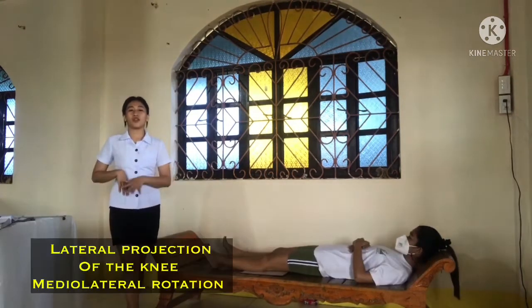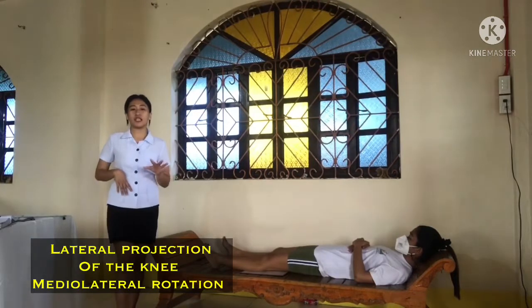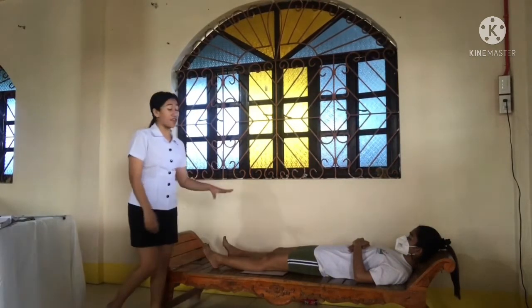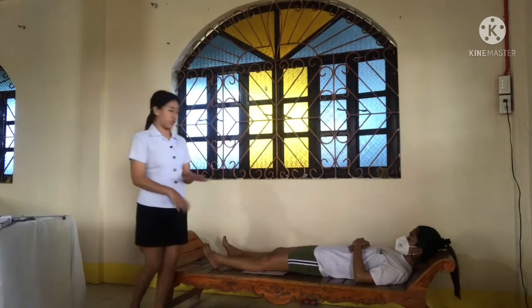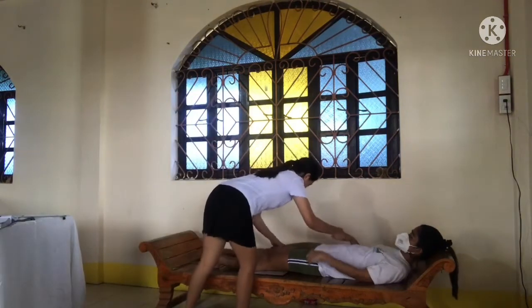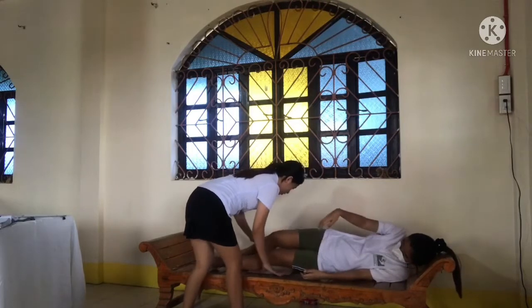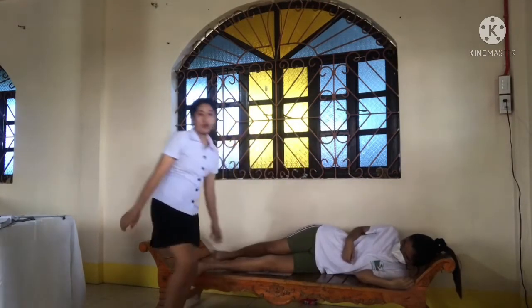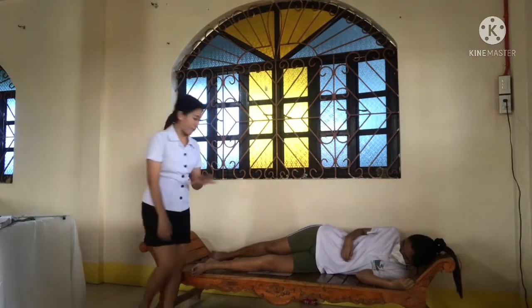So let's proceed to the lateral projection of the knee, mediolateral rotation. So the IR used must be 24 by 30 cm lengthwise. So ask the patient to turn into the affected side. Ensure that the pelvis is not rotated. So a flexion of 20 to 30 degrees is usually preferred.